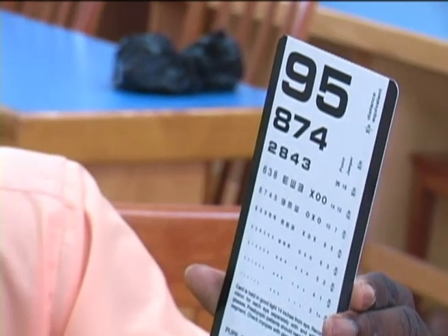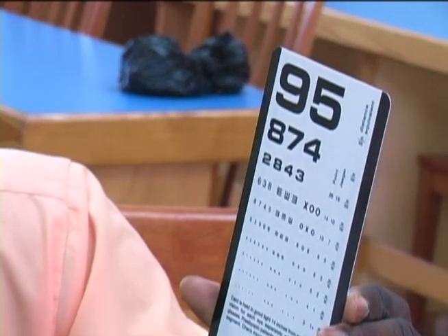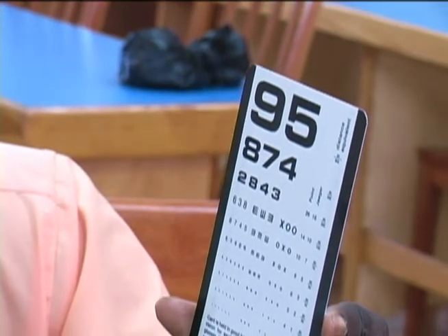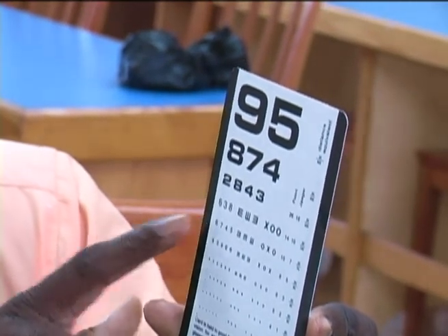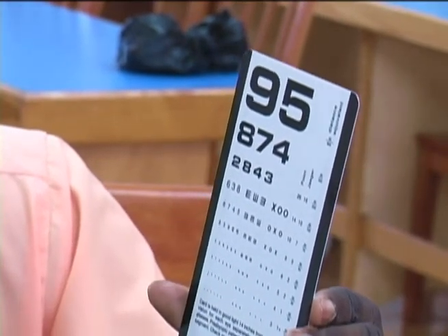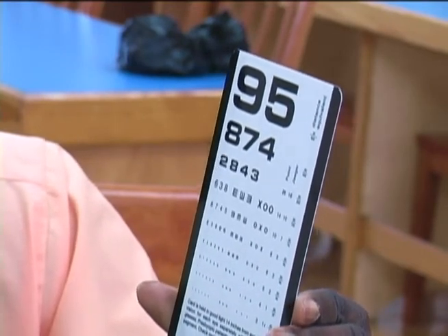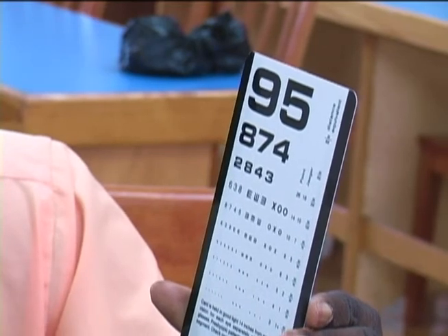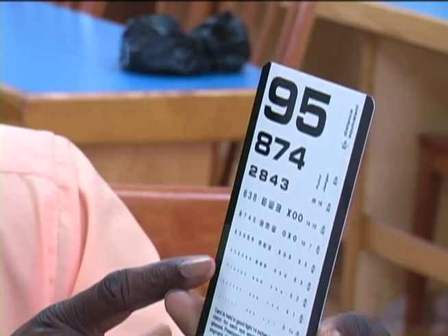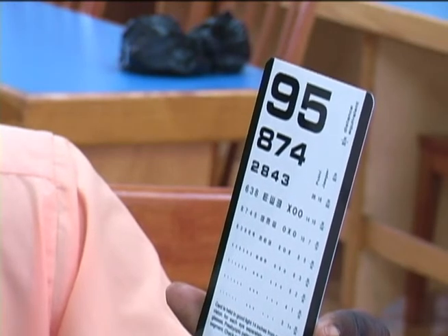The patient is asked to cover each eye in turn with the palm of his hand and read the lowest or smallest type line on the chart that is possible. So he covers one eye, the other eye uses the smallest type that he can see. 639. 42. If a patient correctly identifies more than half the letters on the line, the visual acuity attributed to that line is considered his or her visual acuity.